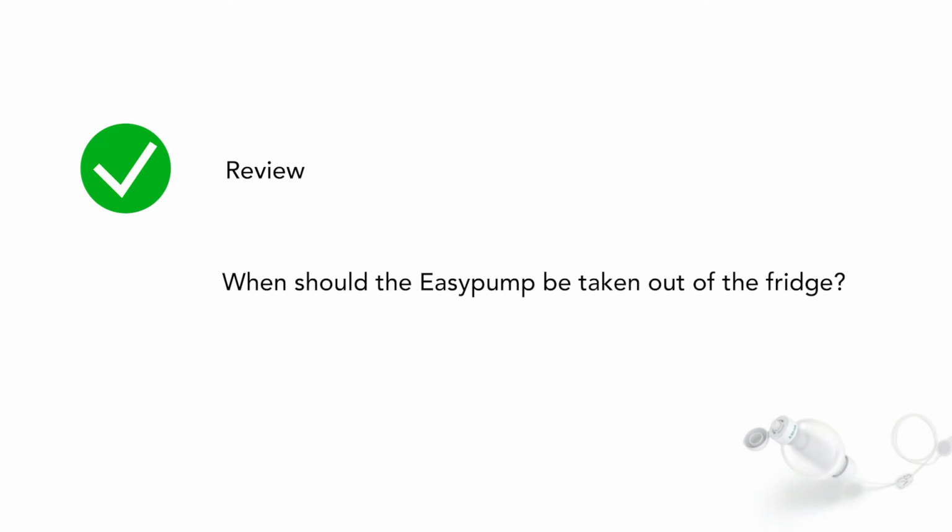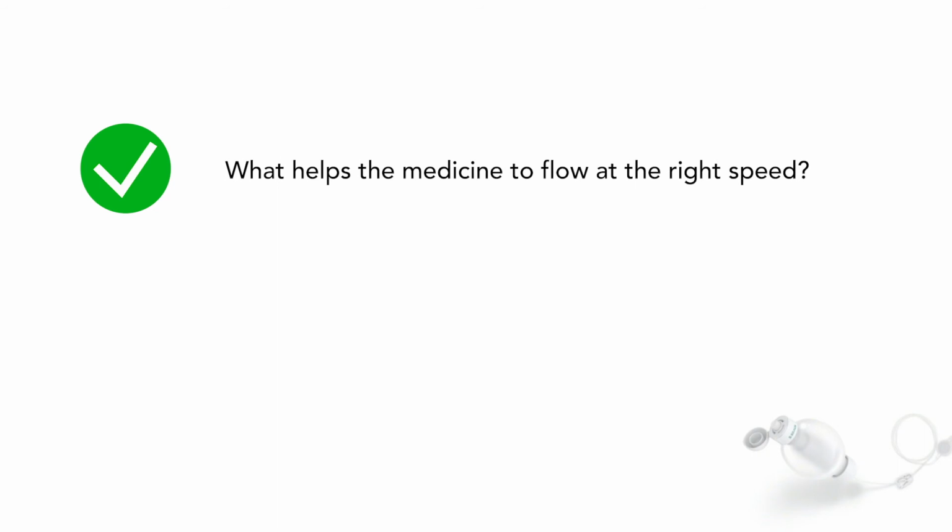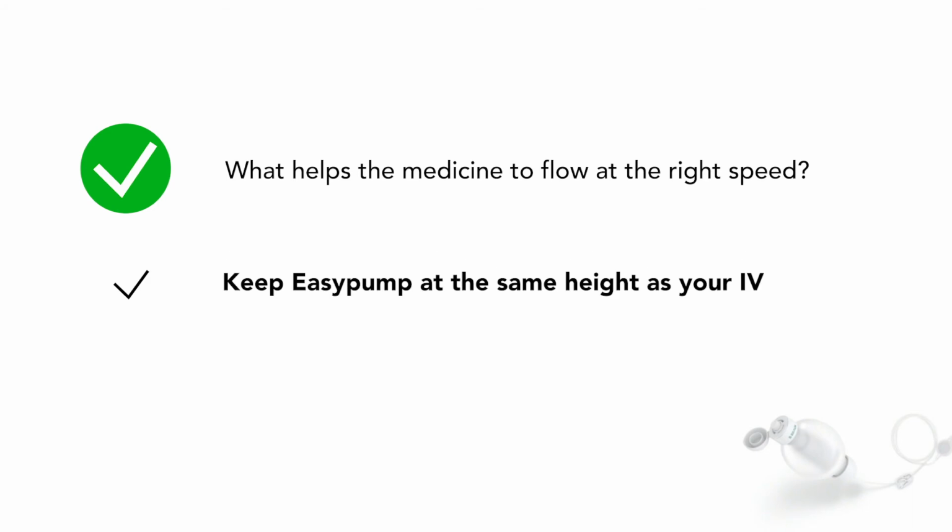Now let's review. When should you take your pump out of the fridge? Make sure you take the Easypump out of the fridge at least 6 to 12 hours before it is time to hook up. Now, what helps the medicine to flow at the right speed? Remember to keep the pump around the same height as your IV.